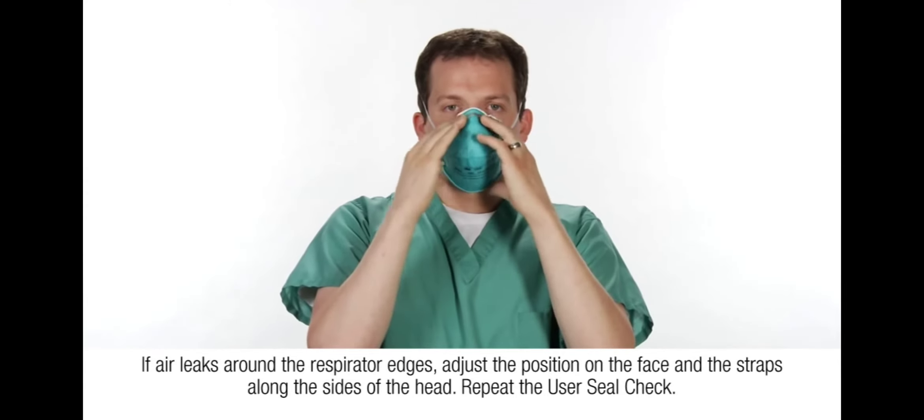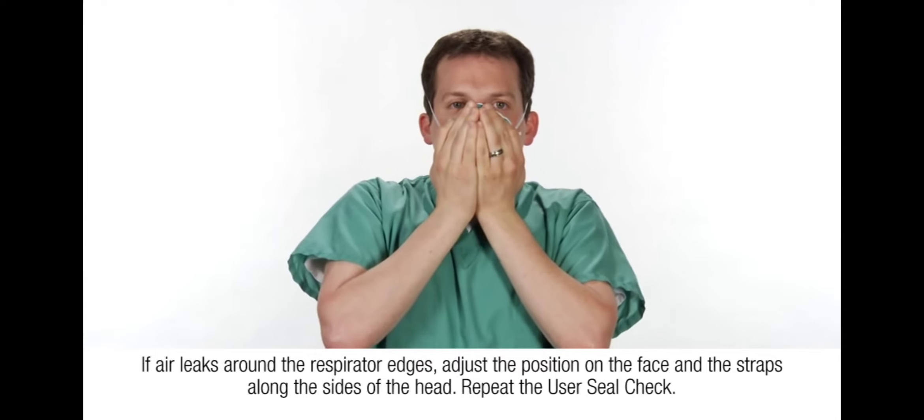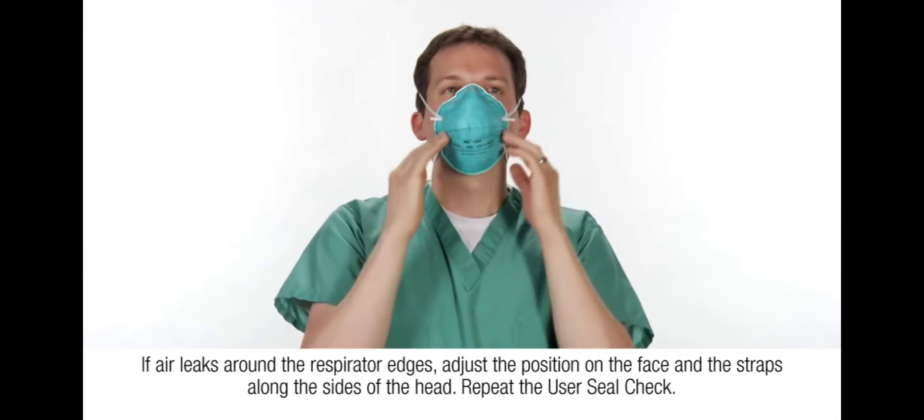If air leaks around the respirator edges, adjust the position on the face and the straps along the sides of the head. Repeat the user seal check.